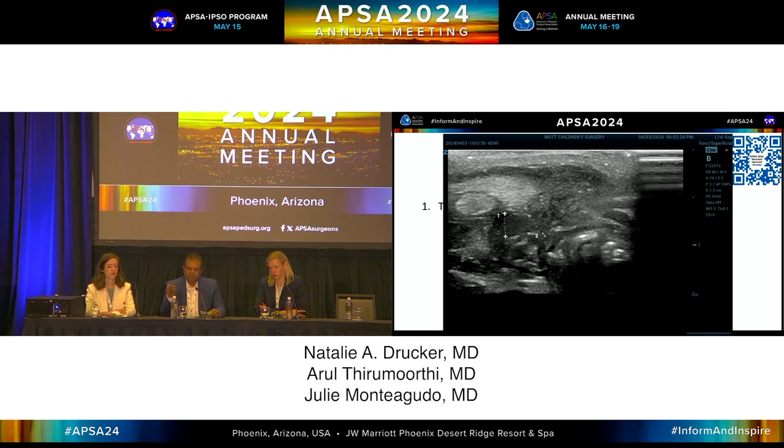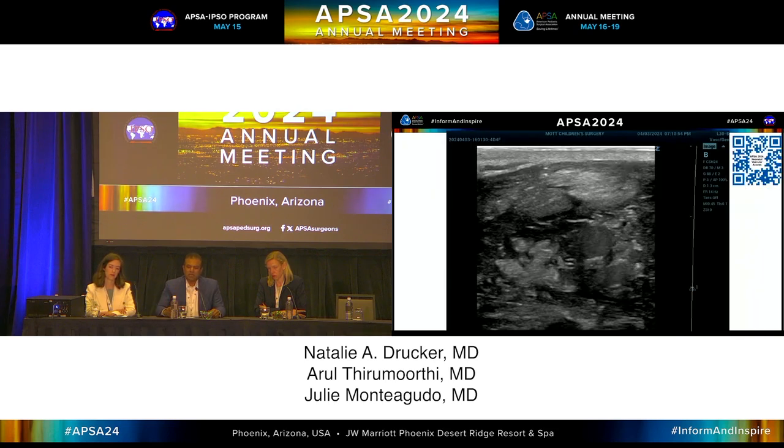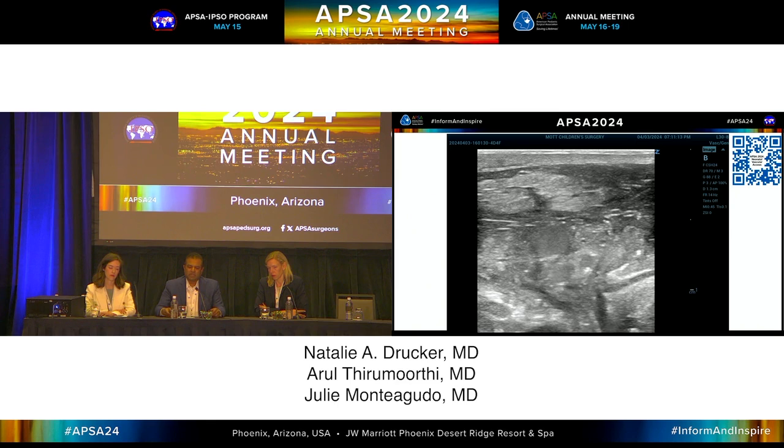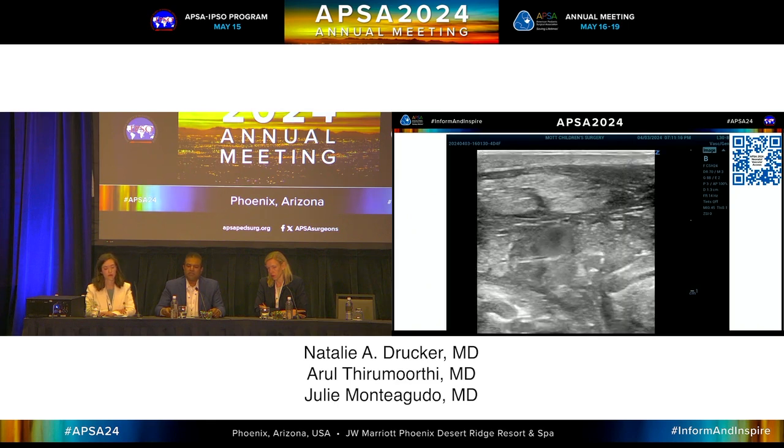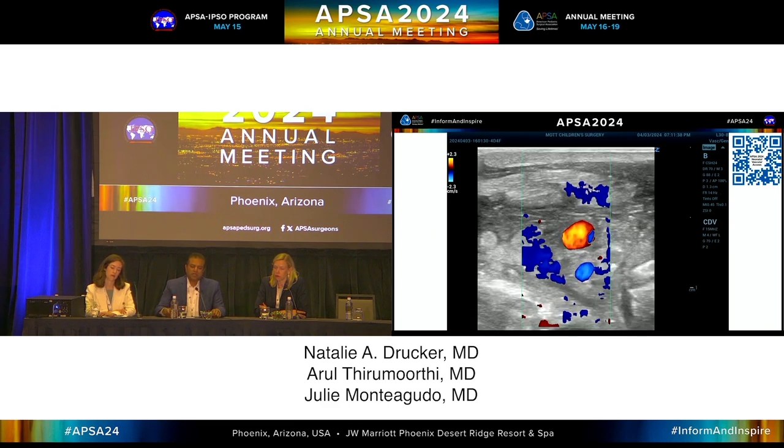So for this initial patient I'm showing you guys, these are the ultrasound images. You can see the carotid in the upper left there, with the measurement, and the upper left is the IJ. This is the other side. This is further imaging. This child gets very edematous, so you can see distortion in the tissues, but you can still isolate the vessels. So this is further imaging for the IJ, and there it is. You can see the sternocleidomastoid, skin up top, the IJ, and then the carotid below it.